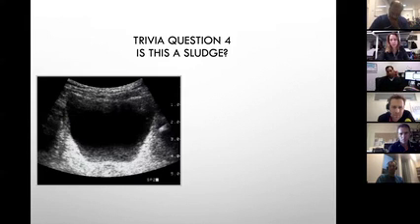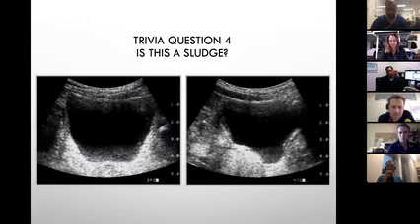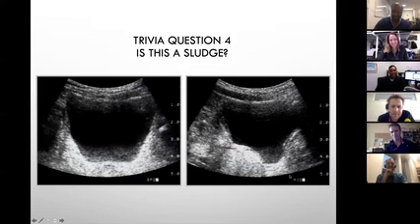Look at it in the opposite plane. Okay, Danielle, got it. Still looks like it's there, but I still think it's a gain problem. That doesn't help, does it? Now you might be capturing the lateral walls. In the slice thickness, in this angle, you might be capturing the lateral walls too. That doesn't help. Anything else?